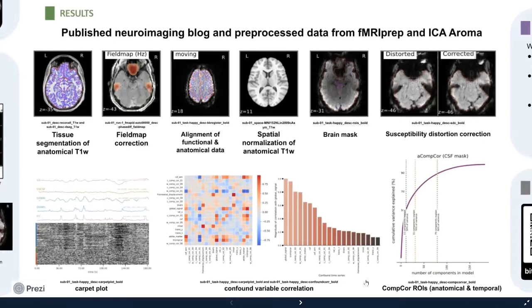The graphs below show the different components that could be potentially unrelated to neural activity and thus removed later, potential time series where movement could have occurred that impacted the brain masks, and components with high correlation that could have further implications in the data and thus help us to further preprocess and remove variables that could impact our future analyses.